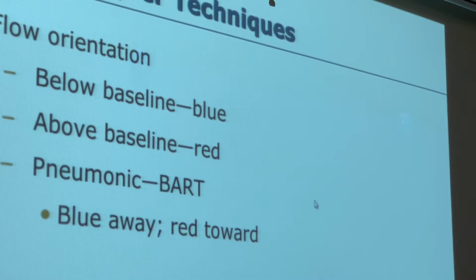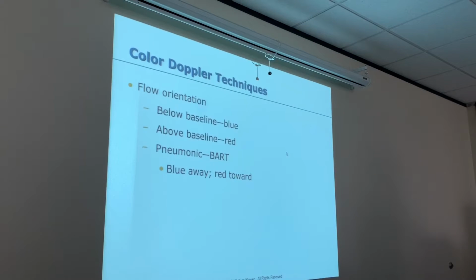Universally, this is what it is. It's blue below the baseline, it's red above the baseline. Blue means away from the transducer, red means towards the transducer.